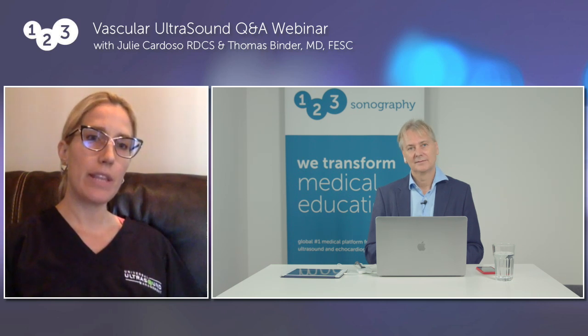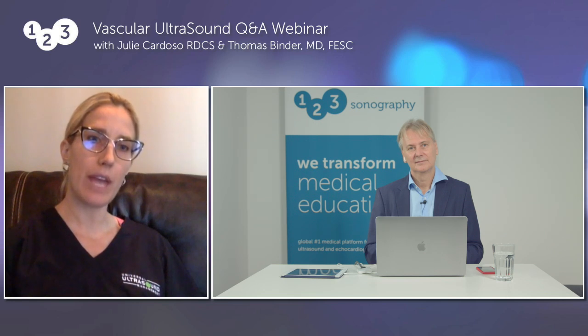No, again, it's really important that you're constantly communicating with your patient, making sure they're okay, asking them if they feel dizzy or lightheaded while they're standing, because it does happen. It happens more often than you'd think. I mean, think about it. You're standing, it's a dark room, sometimes the room is hot, and you're augmenting blood flow towards the heart. So again, communication with your patient is definitely key.